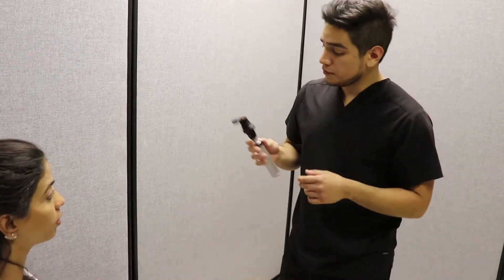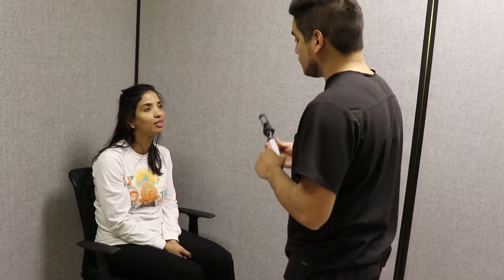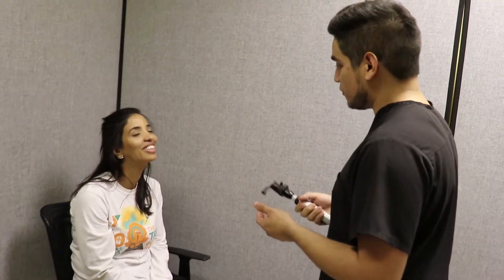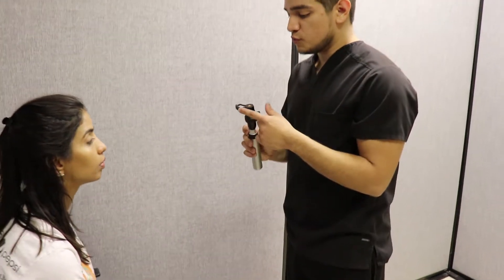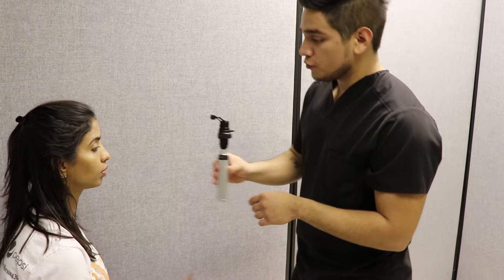So this is the retinometer, which is going to help us determine your macular visual acuity — what it could be after cataract surgery. So what we're going to do here, you're just going to be looking through the little hole here, and this bumper is going to go above your eyebrow. We're going to start with the right eye first.